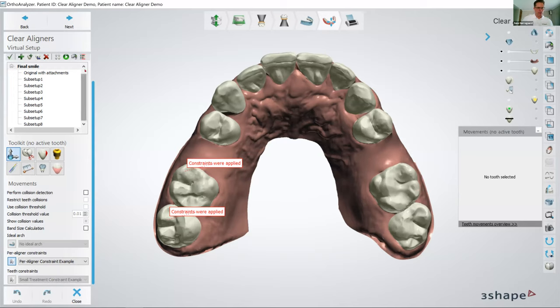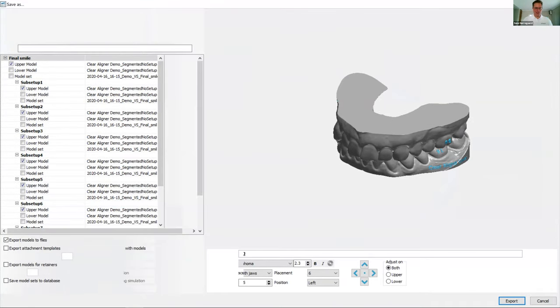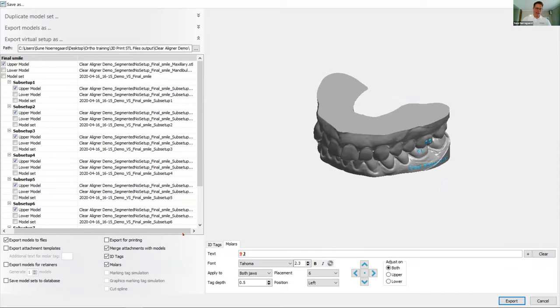Once I'm happy with the whole situation, I have all my setups, then I need to export them into models that will be ready for 3D printing. So I use this icon up here for export. And you can see that once we get to this step here, all the models that will be exported will be the models that have movements. So it's only going to be the upper model that will be exported, not the lower. I can, however, choose to also export the lower if I want to have it. But you can check mark and uncheck mark that. And you can see that it exports into the open file format STL.